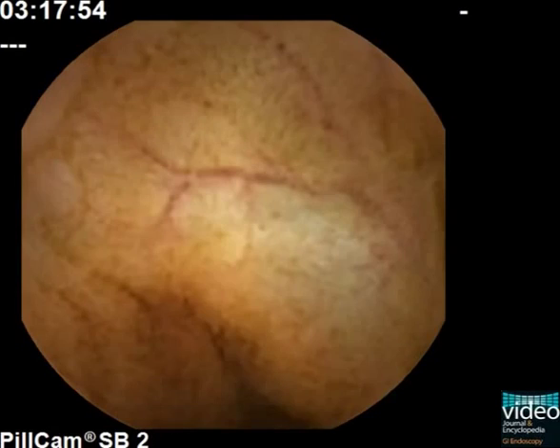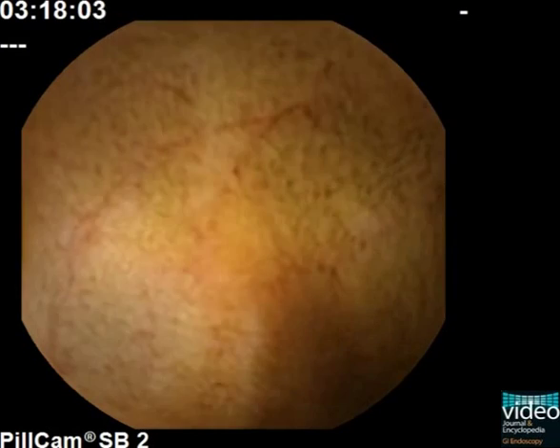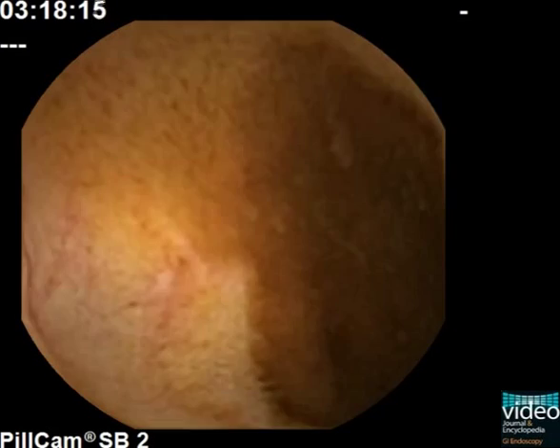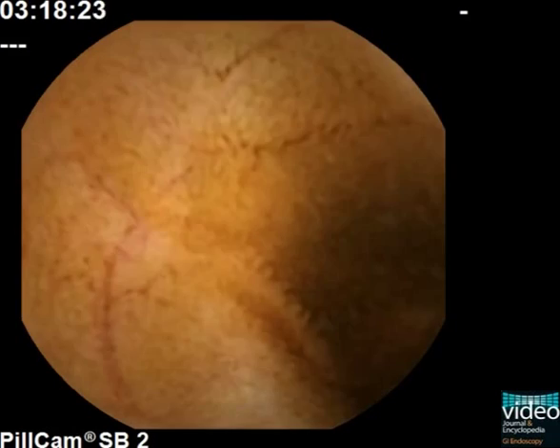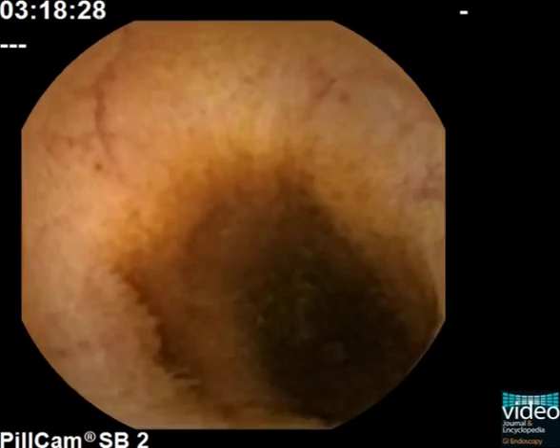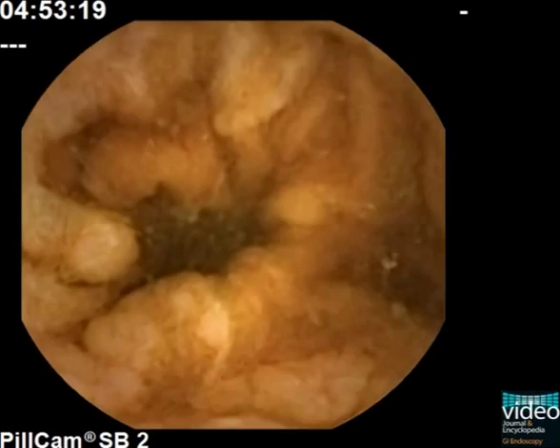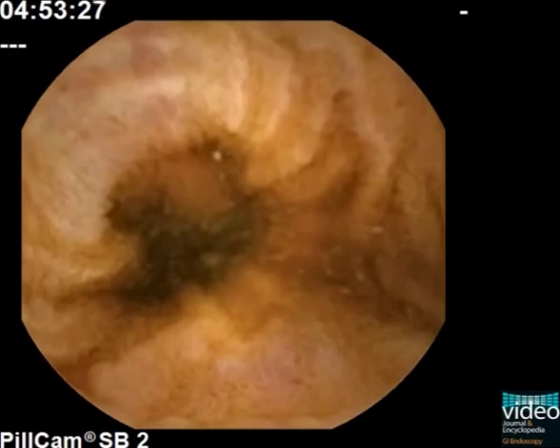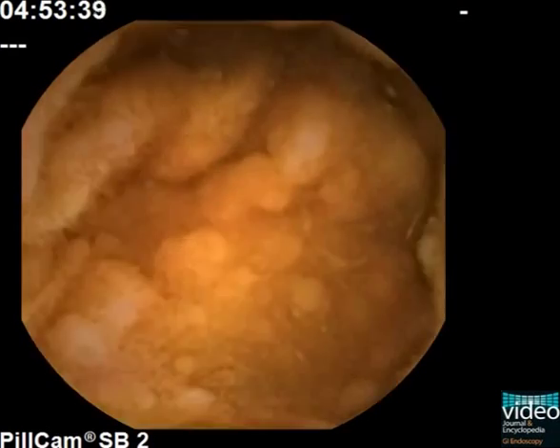A clear-cut transition zone from the jejunum to the ileum is not demarcated by endoscopic means. For practical reasons, the small bowel is divided into an upper, middle and lower third, and the passage time of the capsule is used for definition.